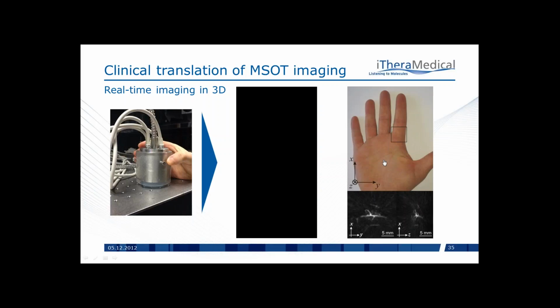We did a similar experiment in the finger, where the vessels are a little smaller, and the size, the shape, and the direction of the vessels is important in certain disease states, such as arthritis. In this case, we have a healthy volunteer, and you can again see the microvessels in each direction in this person's finger.